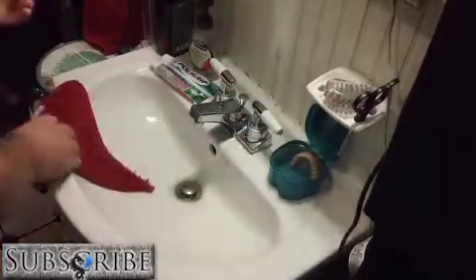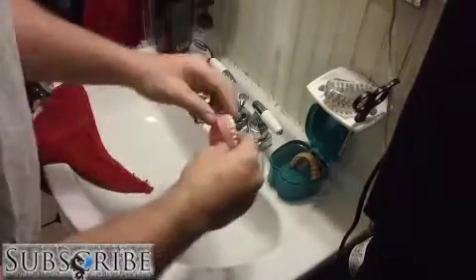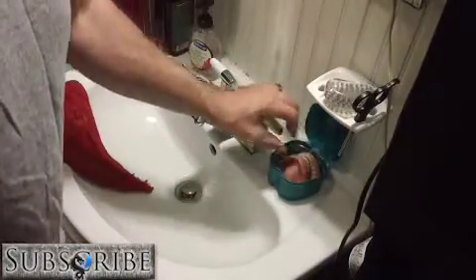And you can always, worst case scenario, blow the little moisture out. I don't need to because I already got it pretty dry, but it gives you an idea. So, next we'll talk about glue more.